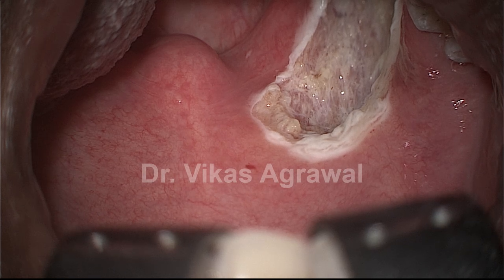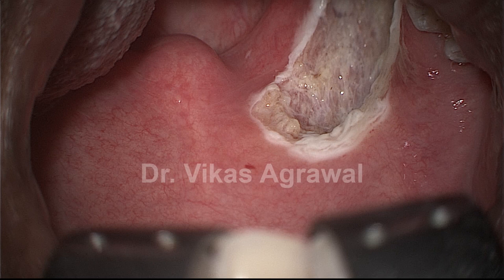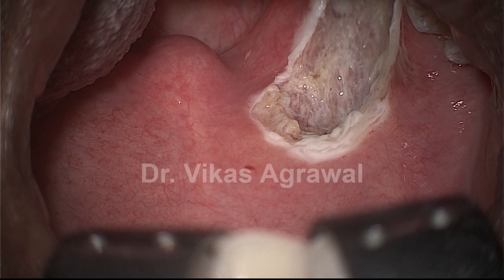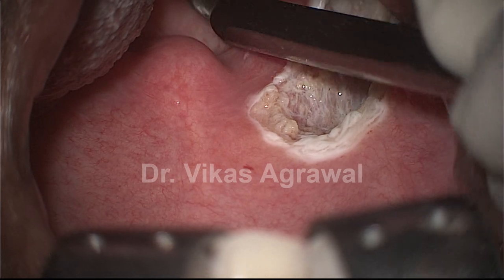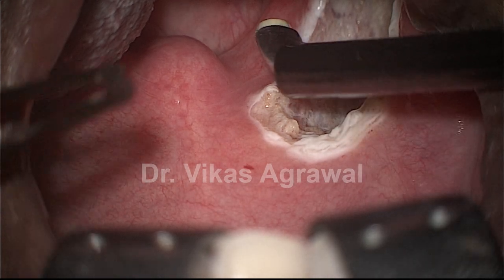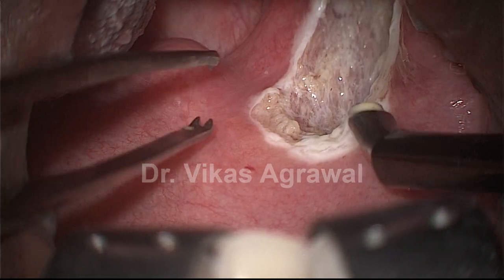Here you are going to watch Barbed Suspension Bridge Pharyngoplasty by Vikas Agrawal's technique in a male who is 29 years old. Body mass index is only 25 and apnea hypopnea index is only 19, but still he has got choking episodes. He has had a nose surgery done earlier elsewhere which has not worked, and on DISE he has got a collapse at the soft palate level and at the epiglottis level.